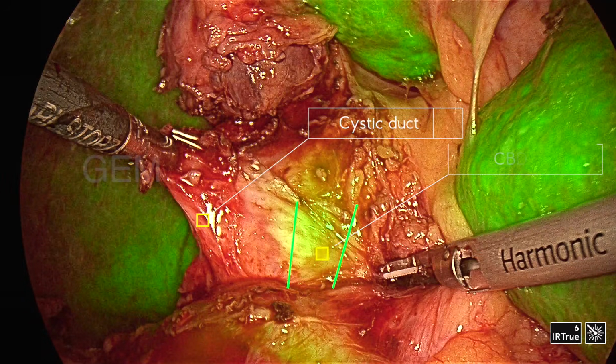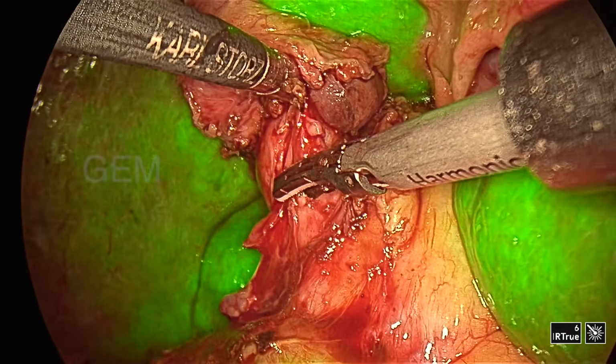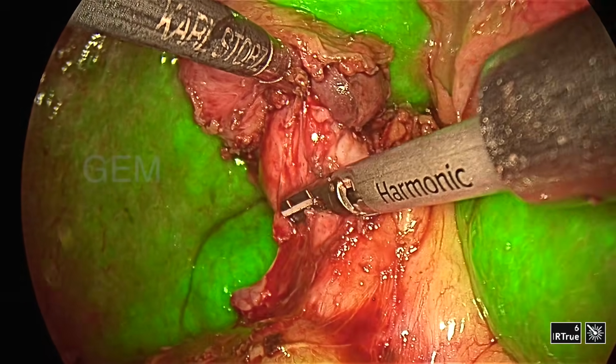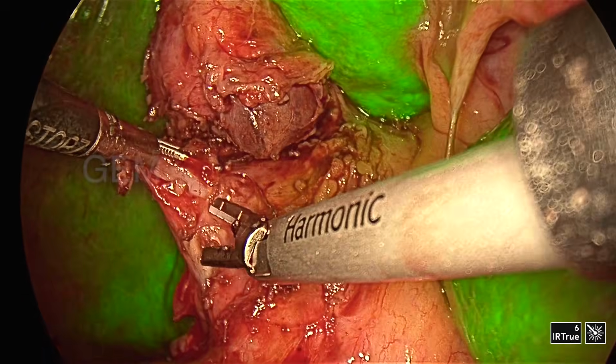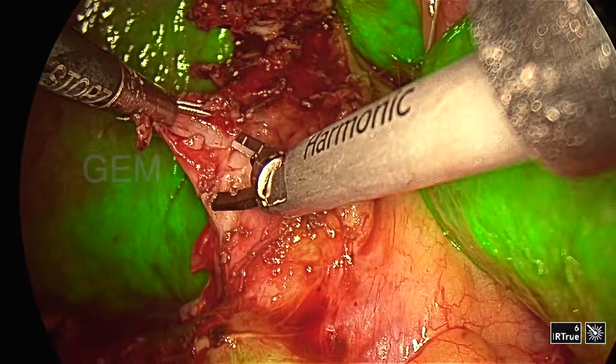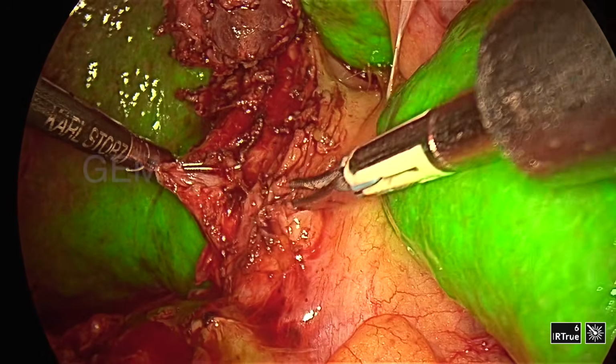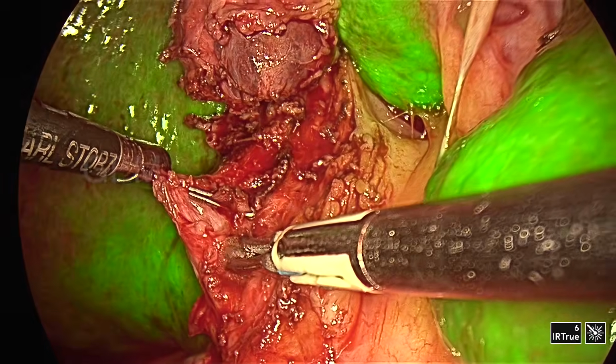See how close it is. You can see it is very densely adherent. If I try to separate the cystic duct from the CBD, definitely I will injure the CBD. In this case stenting is not done preoperatively because there is no CBD obstruction. So just with the IR mode's help, I started doing the procedure.